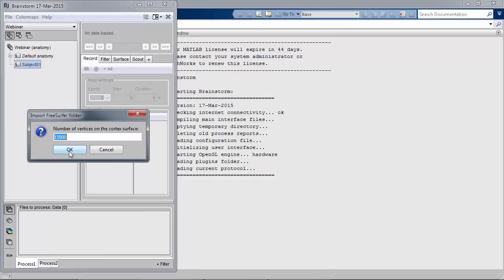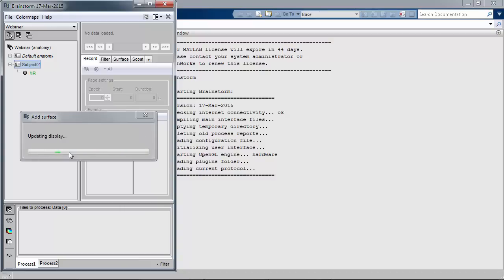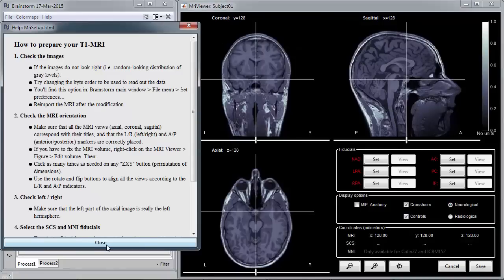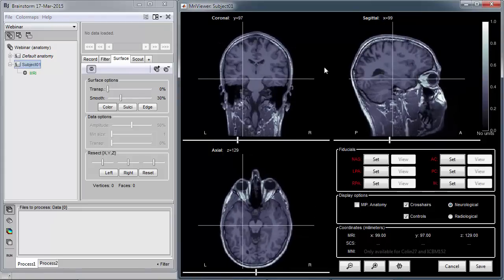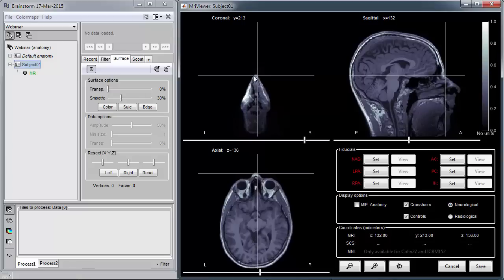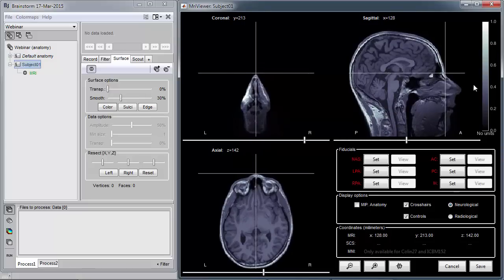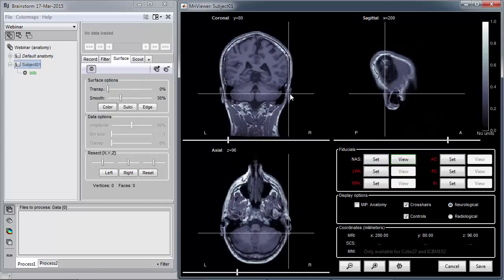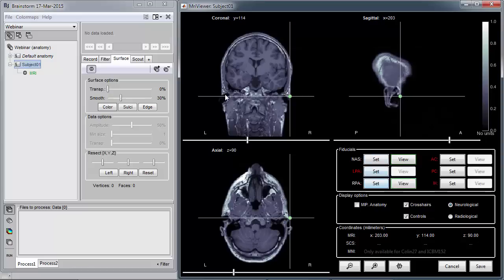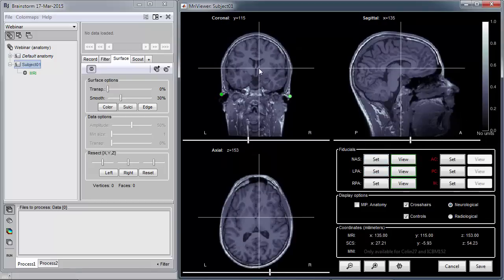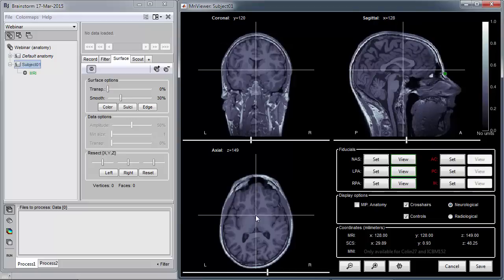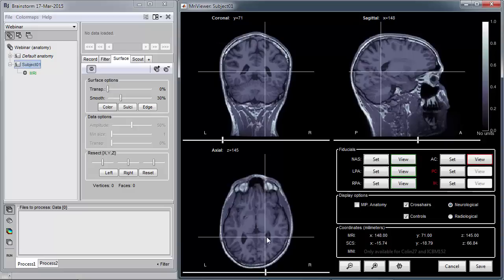The good thing with Brainstorm is that we have the capacity to import anatomy files from a wide range of data formats, from relatively raw MRI files to processed files from the most common MRI processing applications. Here it's a FreeSurfer-processed MRI volume and surfaces. This is the MRI viewer that is fully integrated in three dimensions. You have the three typical orthogonal panels of MR visualization. We're now navigating through the volume and marking three essential points — nasion and right and left pre-auricular points — which are necessary to register MEG and EEG recordings with the anatomy.